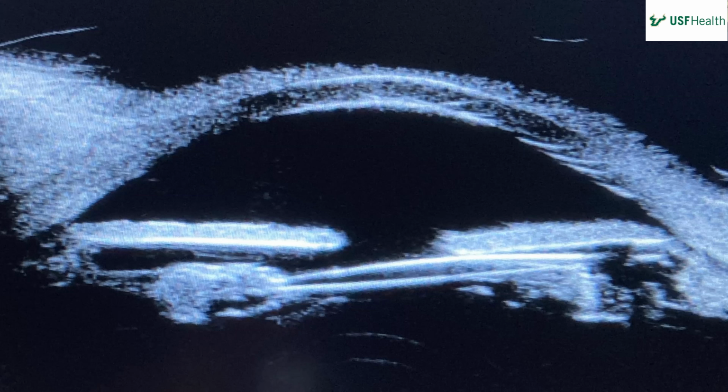Okay, so yeah, that's the IOL, right? Mm-hmm. So I'm pointing, but they can't see that. Sam, you've got to point to it. So yeah, that's the IOL, and then the ciliary body is just over on the side. Sam, can you tell where the ciliary body is? Yeah, way over there, that's your ciliary body. And then that's just a bunch of debris.